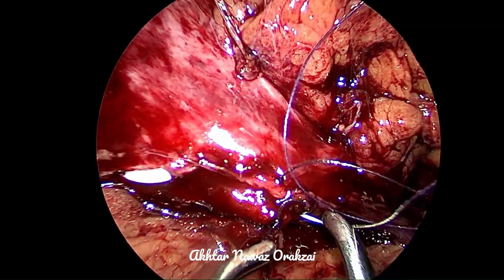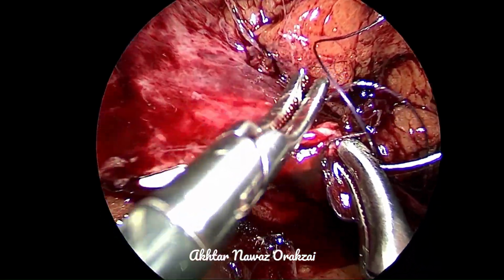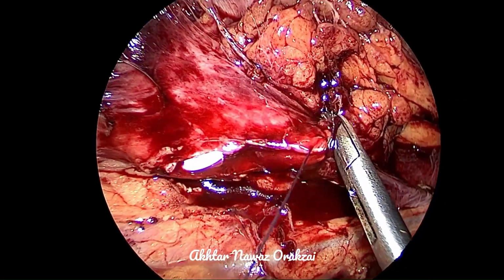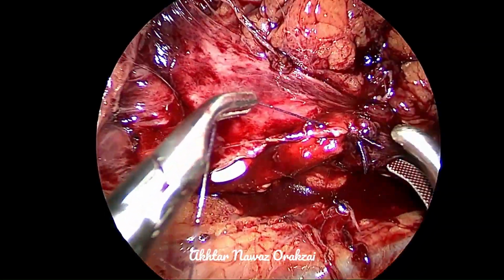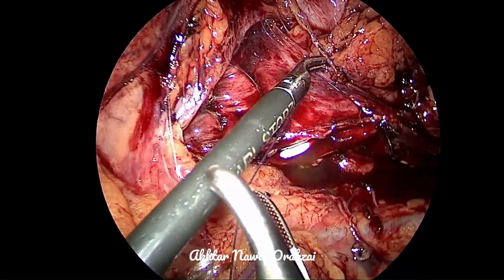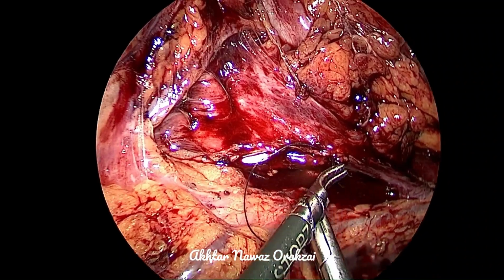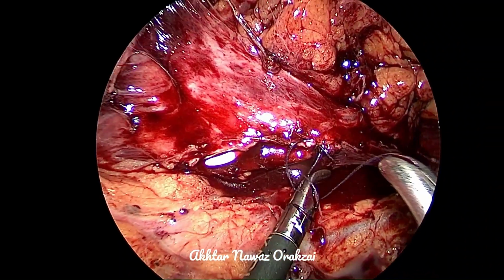So we have reached the tip of the ureteric anastomosis. Here we will bring the old loop through the new suture loop. Here you can see, so they are very nicely approximated. Then we are going to knot the new suture to the old loop, so that the anastomosis or the suture line does not get loose.